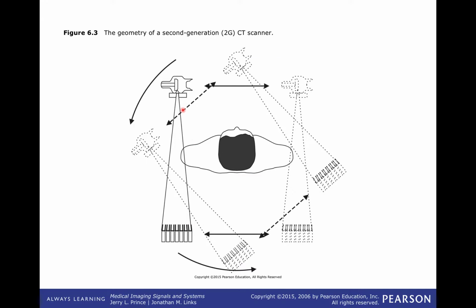You can make this faster, obviously, by making the beam of radiation a little bit broader. You can make it faster by making, instead of a very small, non-powerful source of radiation, you can put it in an X-ray tube there, an X-ray light bulb, make it powerful. So you've got a lot more radiation, and that way you can raster across more quickly, right?